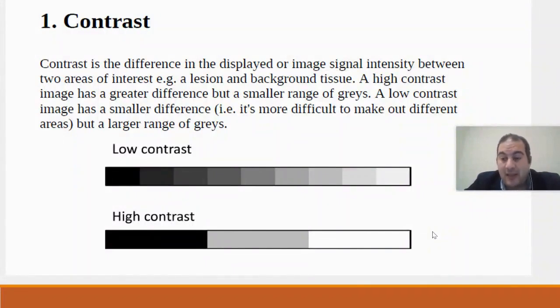I brought the same thing that I am imaging, the one I am using. For example, it refers to its effect on contrast and the milliampere settings. The next parameter is the type of detector itself, whether it is screen film radiography or digital radiography. This also affects the contrast in my image.